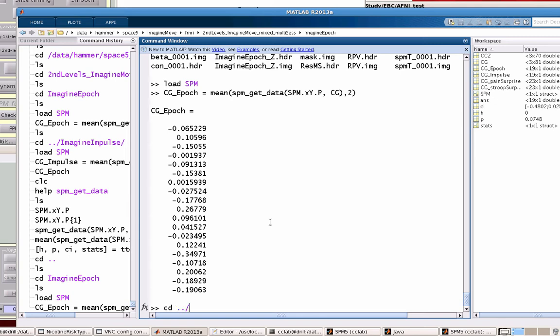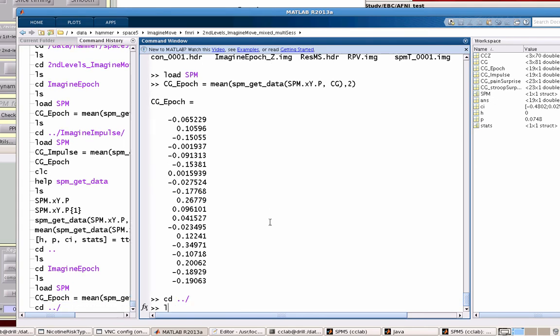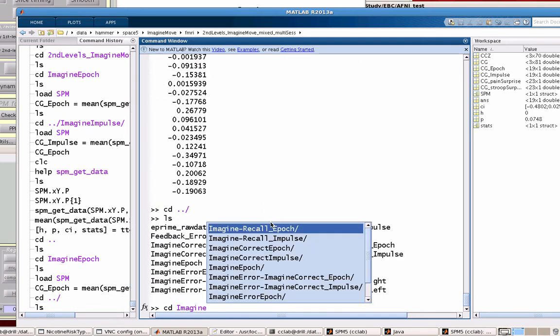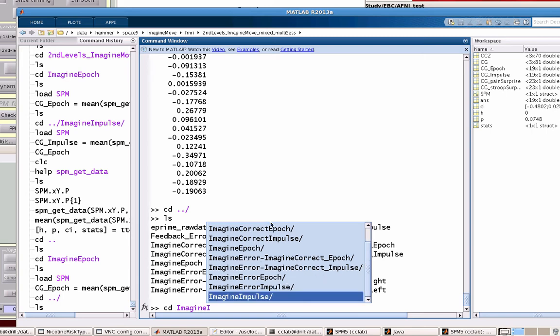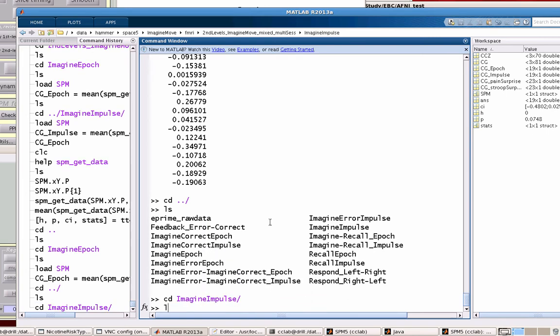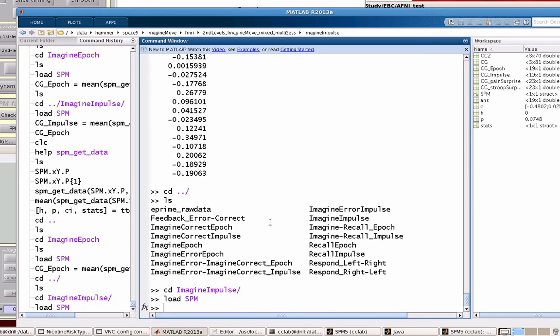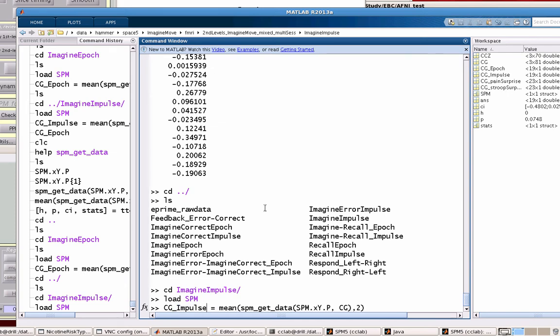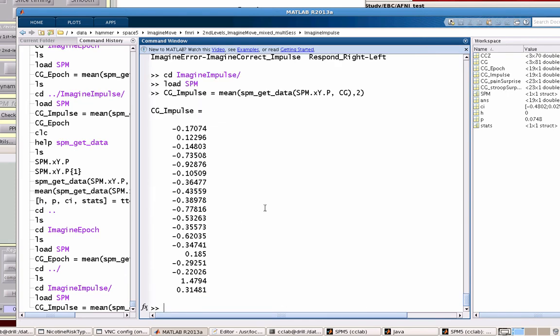And then I can go to another directory, say ImagineImpulse. Load the SPM, and I can do the same thing here, just tweak the name slightly. This is really cool because now I can do a direct contrast between these different sets of contrast estimates.